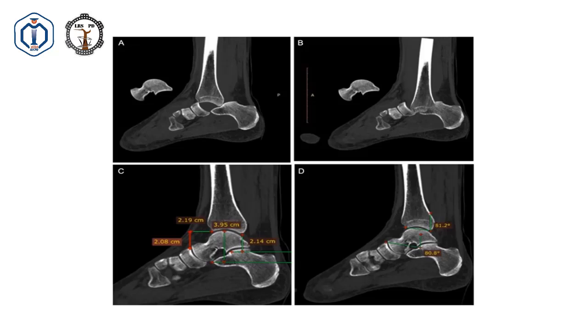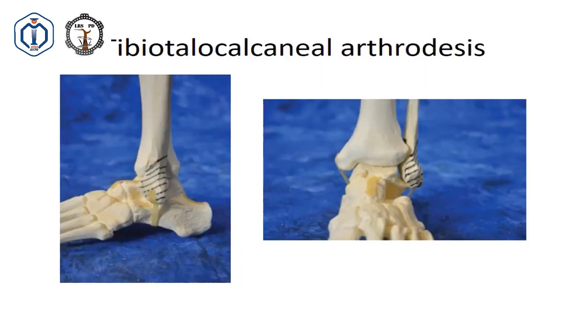Here is another strategy of doing the ankle tibiocalcaneal arthrodesis with preserving the height, so the calcaneus is under the tibia and the navicular is also under the tibia. So you match the height and you keep the height of the foot. This means decreasing the amount of shortening, and it has the advantage of wearing shoes, so you maintain the foot height.